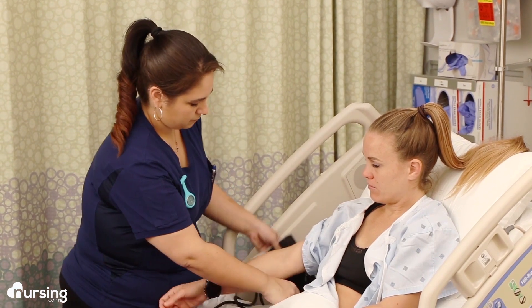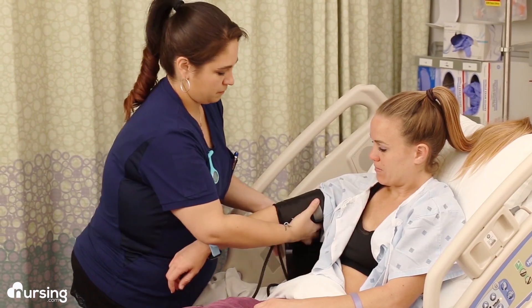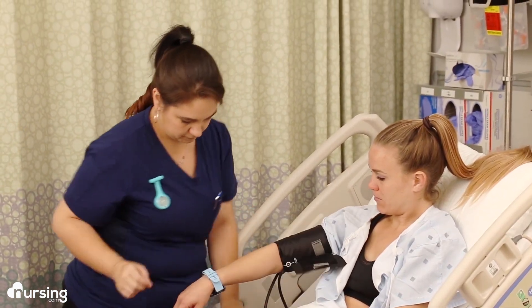Then you're going to palpate for the brachial pulse on the inside of their elbow and wrap the blood pressure cuff around their arm with the indicator line pointing to that brachial artery.